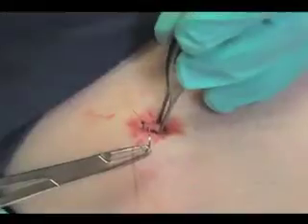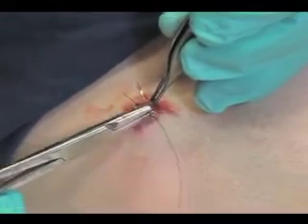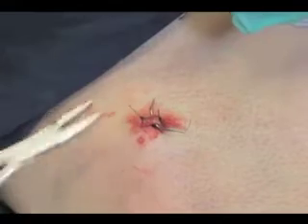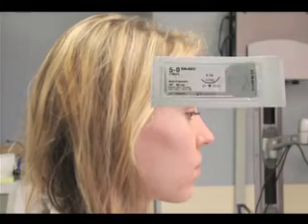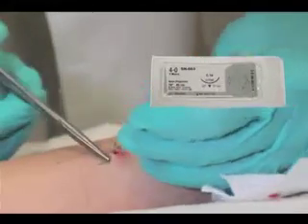This option also has the added benefit of not requiring the patient to return for suture removal. For larger biopsies, the wound should be closed with a non-absorbable suture such as nylon or polypropylene. In general, for thick skin such as the skin on the back or volar skin, a 3-O reverse cutting suture is advised. A 5-O suture is recommended for the face and a 4-O suture for the rest of the body.